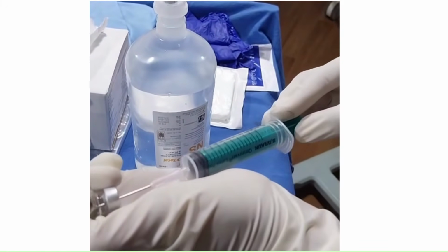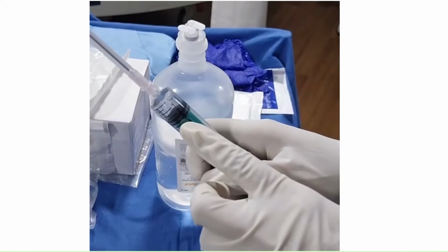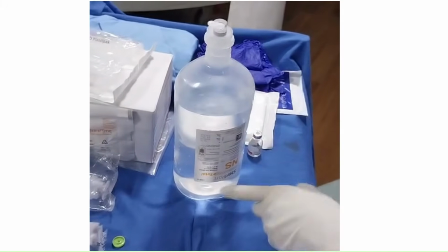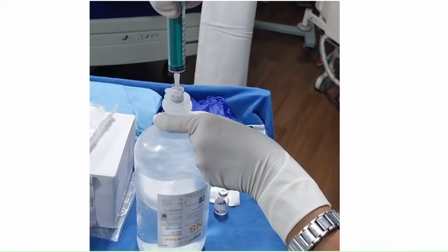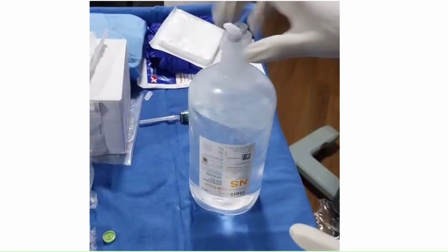So now we are going to take 2 ml of heparin and add it into 1000 ml of NS and mix it gently. This 1000 ml NS should be clamped into the replacement line and the priming is to be started.